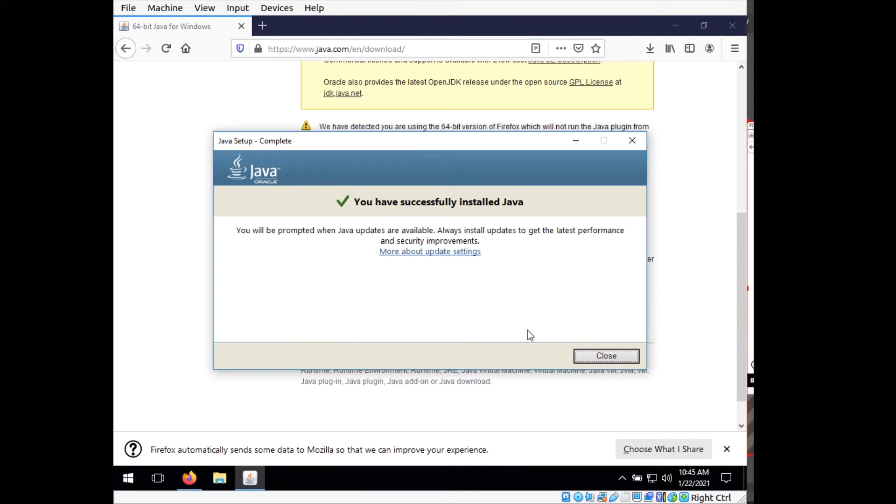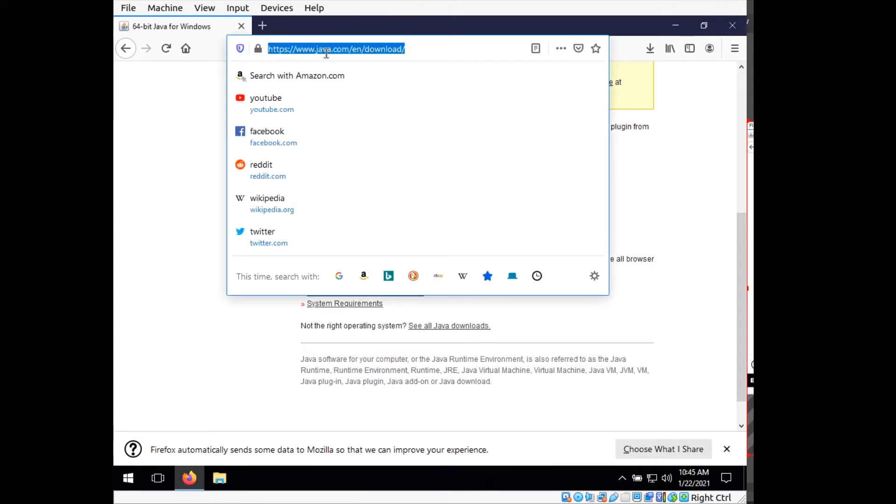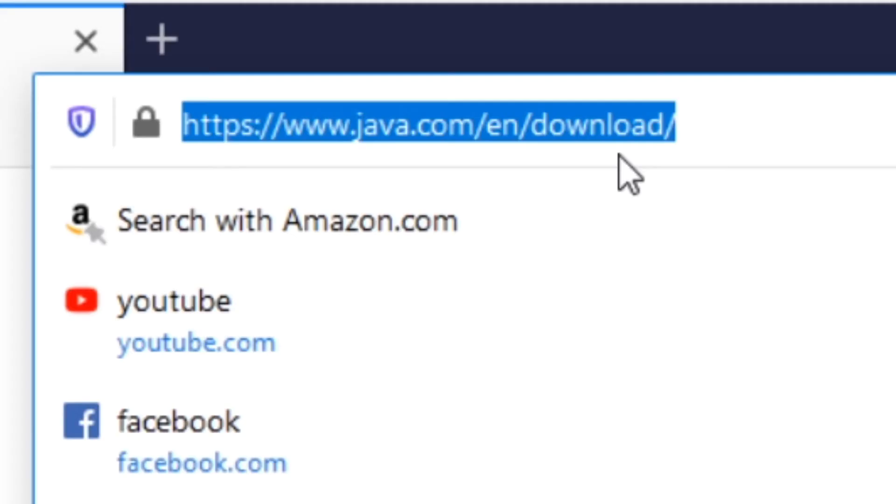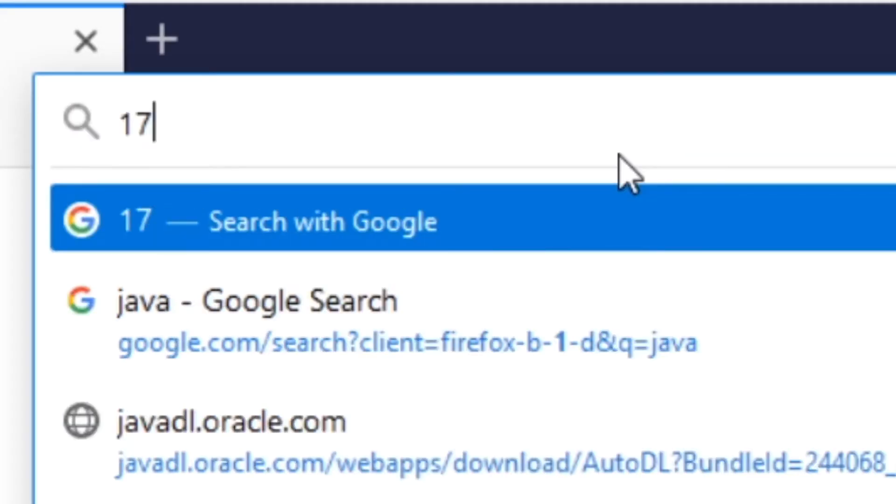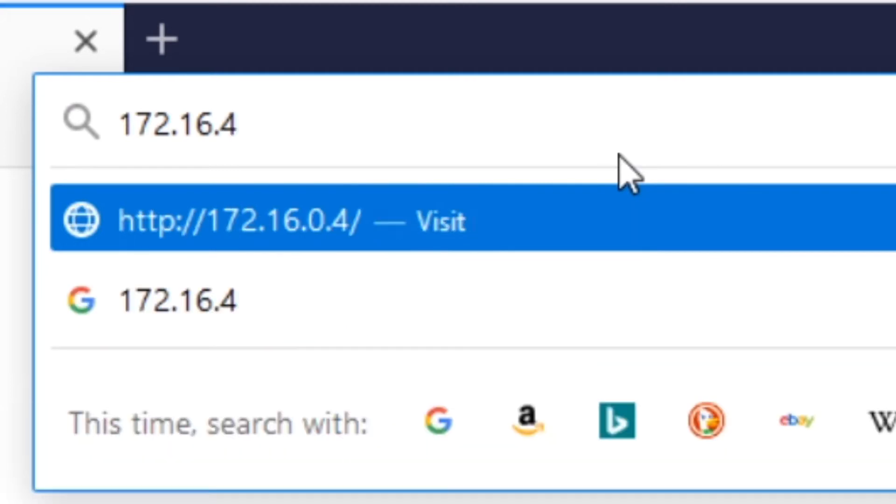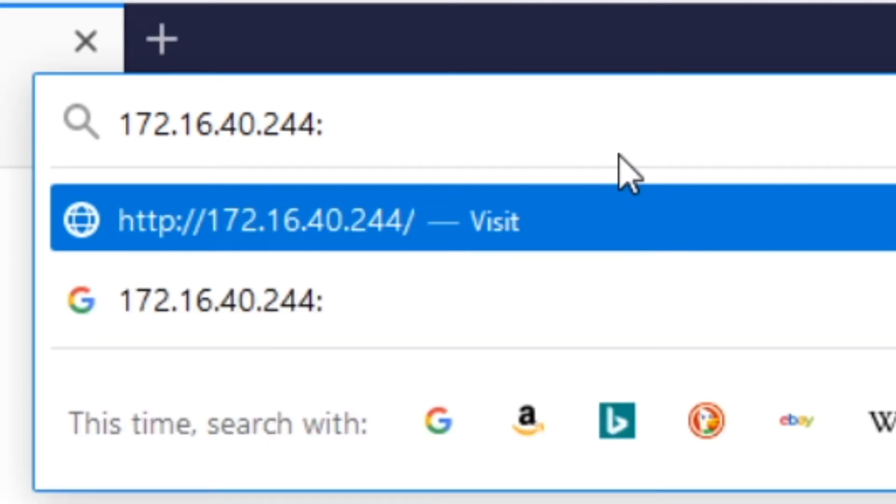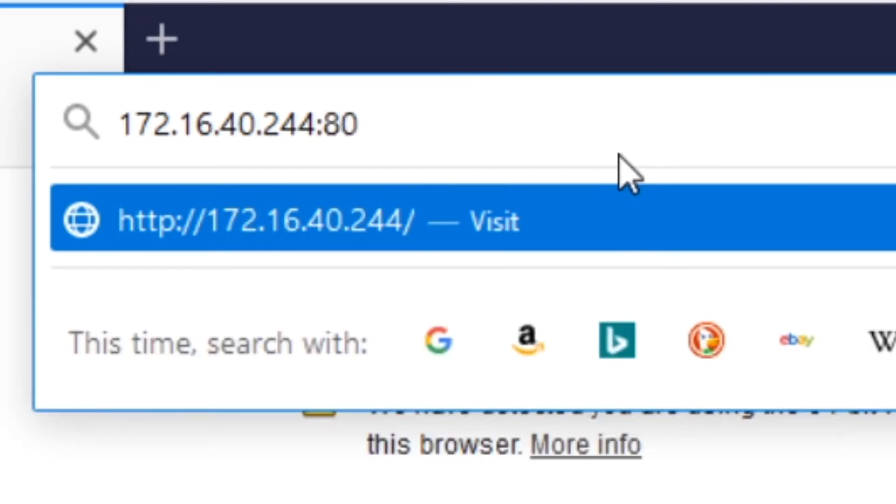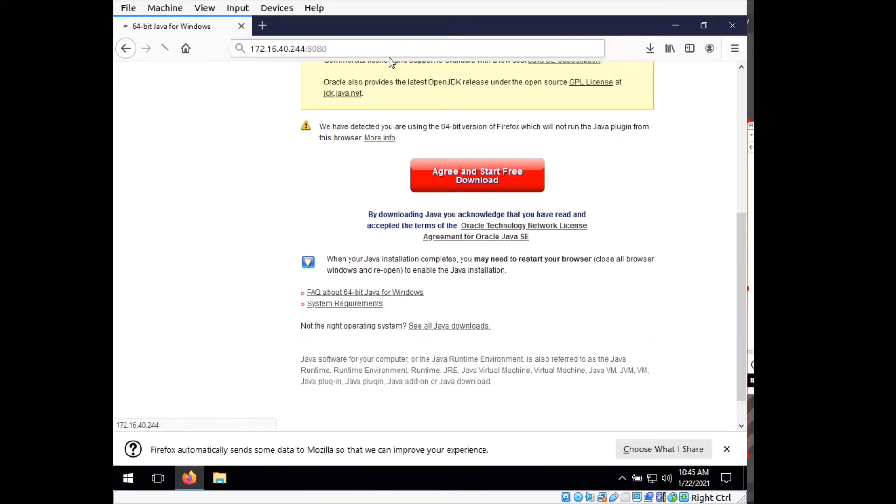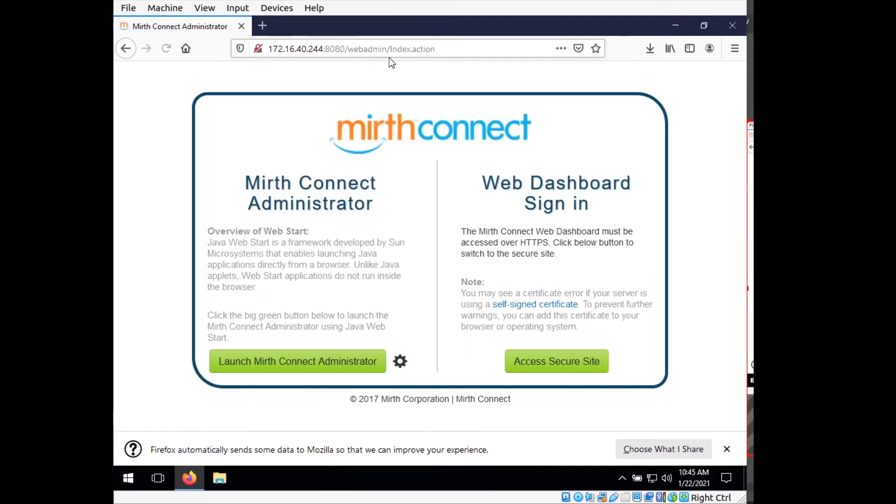Okay, now that Java is installed, we can go ahead and close out of this. In our web browser at the address bar, we want to type in the IP address of our Mirth server. So 172.16.40.244, which is the address of my server, and colon 8080. You'll see this page come up, and we're currently talking to our virtual machine that we set up earlier.